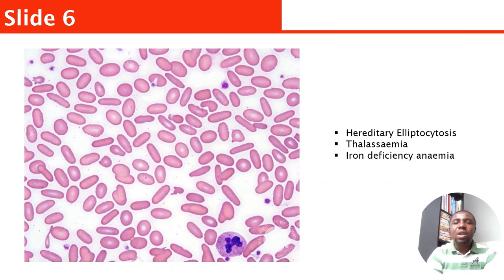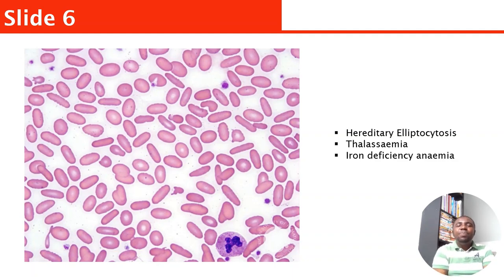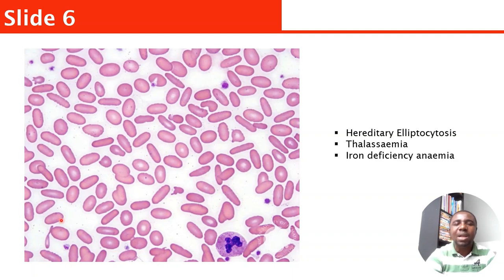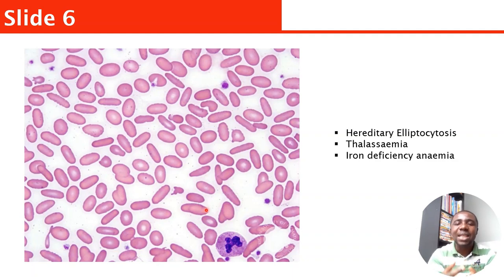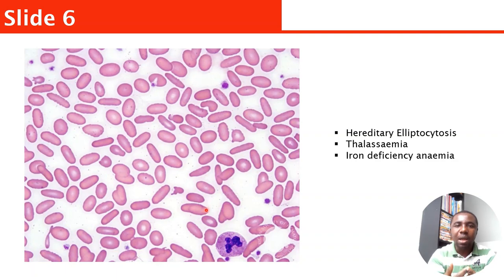This slide shows a lot of elliptocytes — those elongated, pencil-shaped cells. This is called hereditary elliptocytosis because there is a high number of them here. This can be commonly seen in thalassemia and iron deficiency anemia.